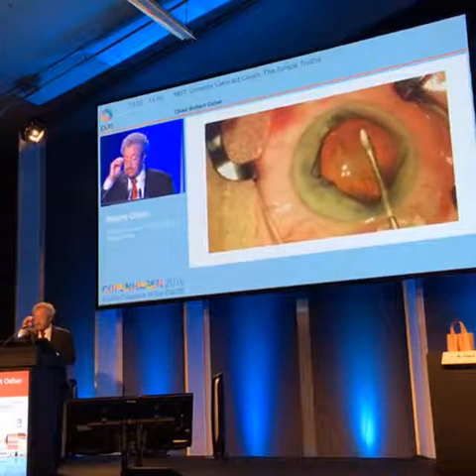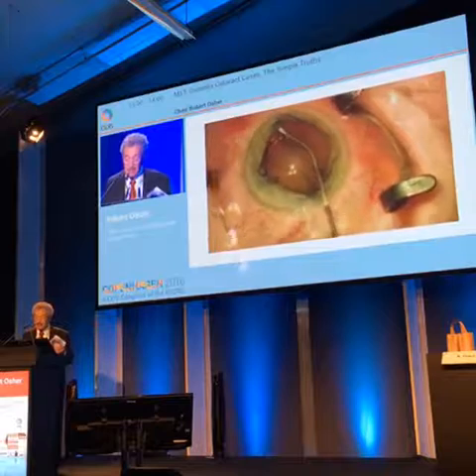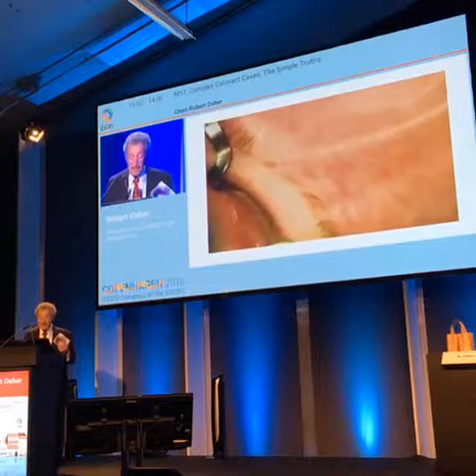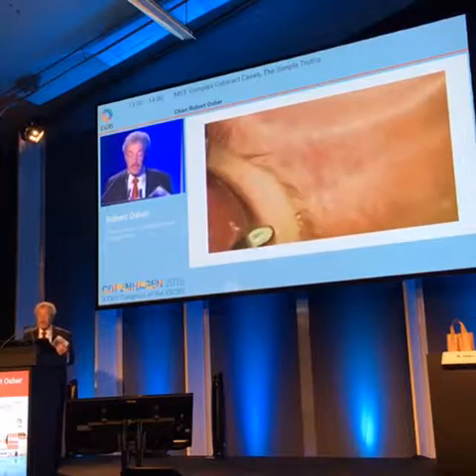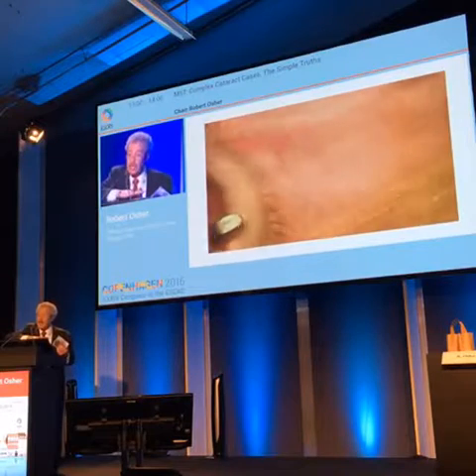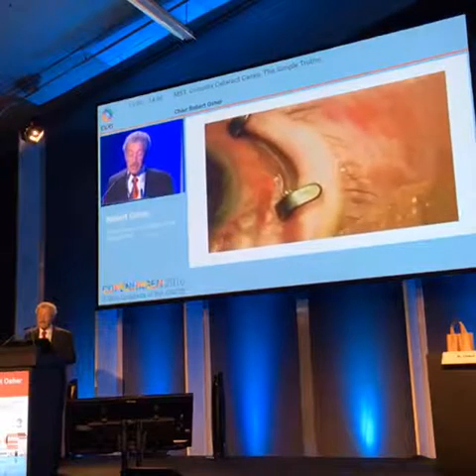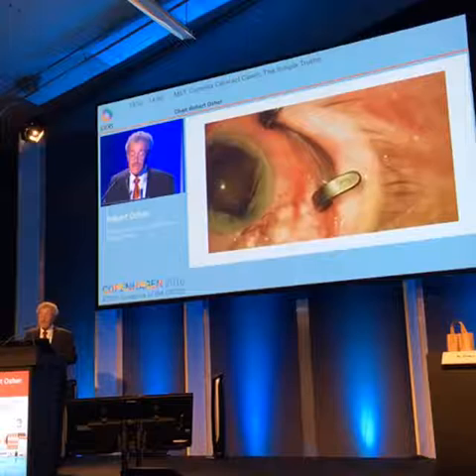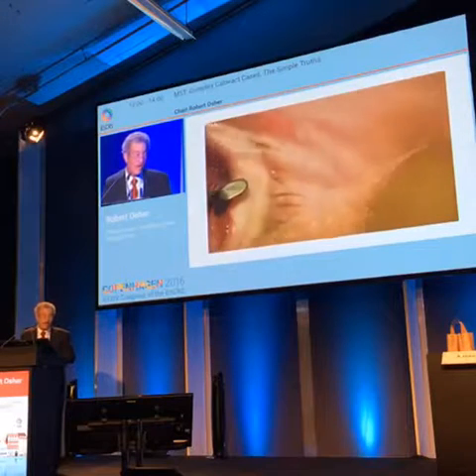I do the rhexis in this patient, and this is going to be very interesting because I'm hydrodissecting the lens, and then the patient decides she wants to leave. She's had enough. So she's disoriented. The anesthesia people gave her too much anesthesia, and she doesn't know where she is. My scrub nurse falls over onto her chest to keep her on the table. And I wish you could hear the sound because I'm being very reassuring. I'm saying, please give me anesthesia. And we calm her down.